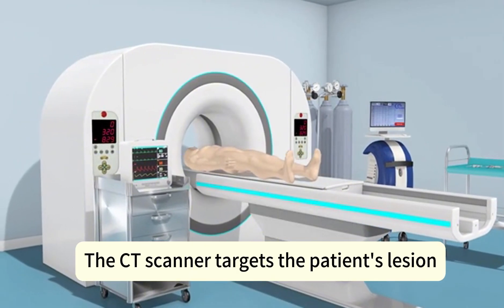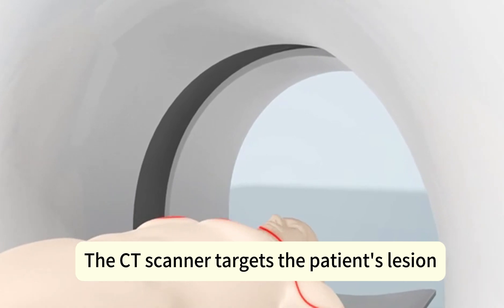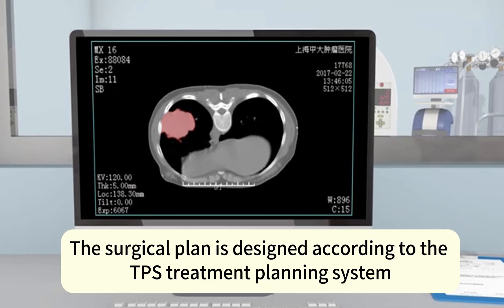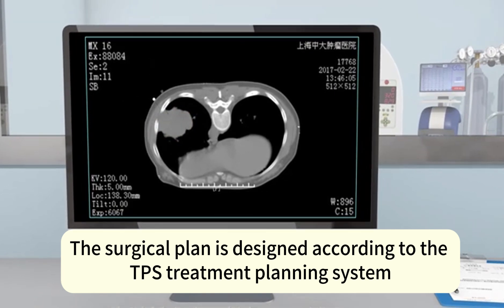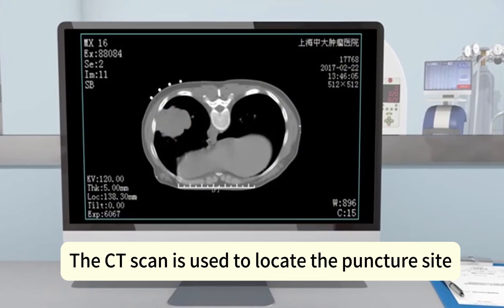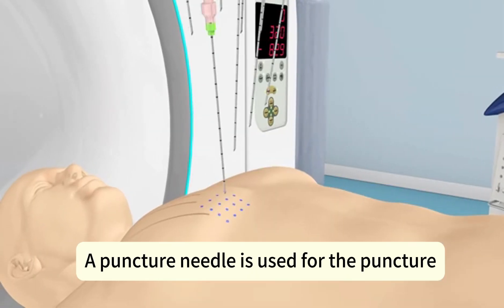The CT scanner targets the patient's lesion. The surgical plan is designed according to the TPS treatment planning system. The CT scan is then used to locate the puncture site.